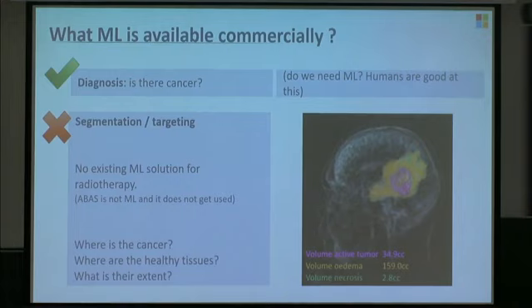So there are techniques that are based on what's called atlas-based auto-segmentation, where we use deformable image registration and bring over normal tissue contours. Some of those are available at commercial grade. We've evaluated several of them and thrown them out because the trouble is if they're not good enough and it takes you longer to fix up than it would do to start from scratch, no oncologist is actually going to use those tools. So that's a real problem. So we need something better, and that's why perhaps an ML solution like the one that we've been working on might be interesting.